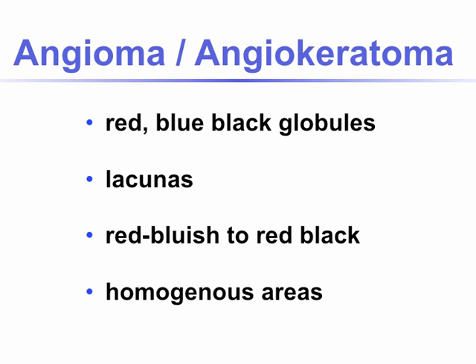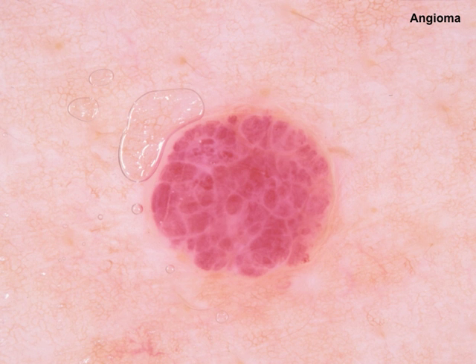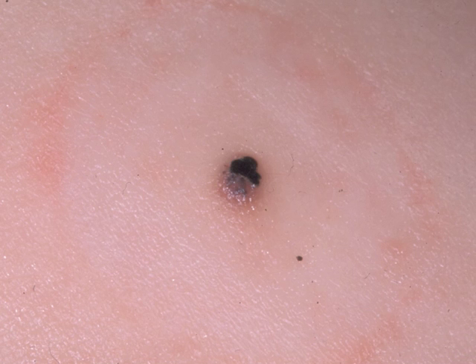Angioma and angiokeratoma: they are red-blue-black globules or lacunae of red-bluish to red-black color. They have homogeneous areas and are sharply demarcated. This is a typical clinical picture of cherry angioma. The dermoscopic view shows homogeneous, large, sharply demarcated globules, very typical for vascular lesions. Sometimes it's not as easy because these vascular lesions could have a thrombosis or partial thrombosis, and congealed blood has the blackest of the black color that you could get.